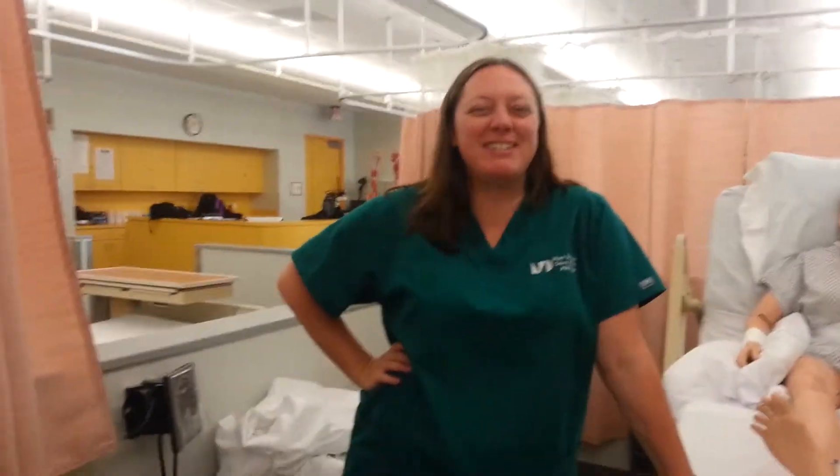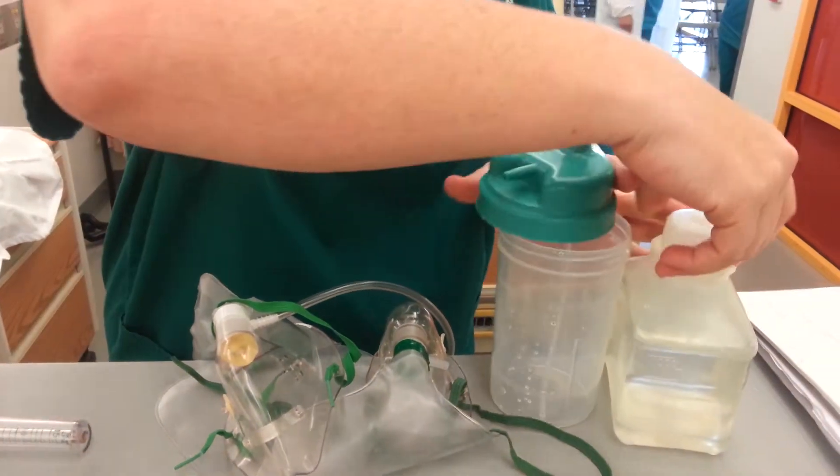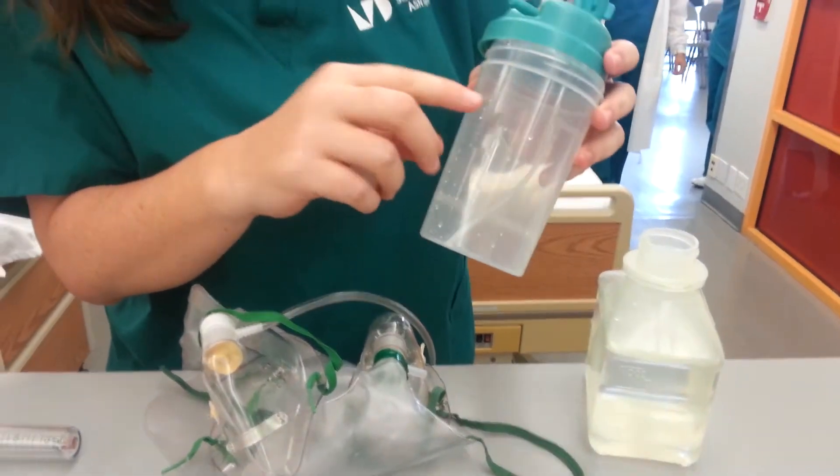Hi folks, it's respiratory time. The first thing we have to do, besides introductions and all that, is pour the sterile water to our lovely little fill line.